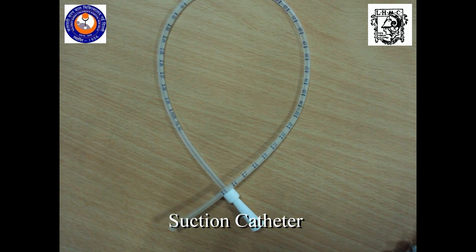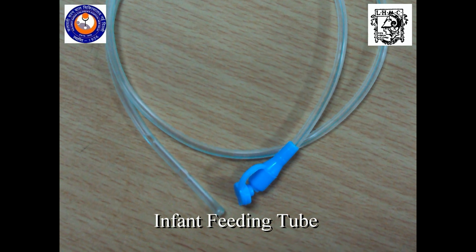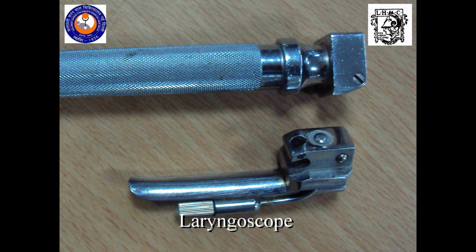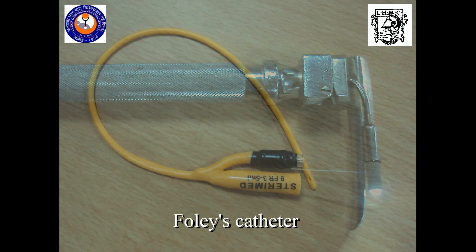Suction catheter, infant feeding tube, laryngoscope set with a battery handle and a blade, Foley's catheter.